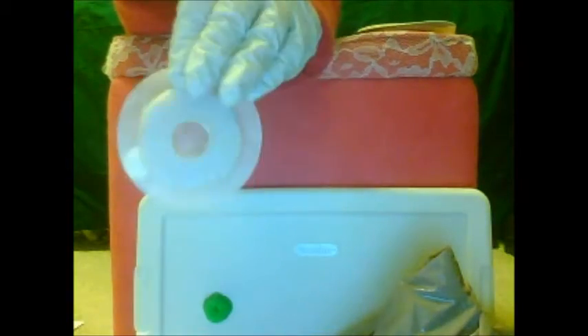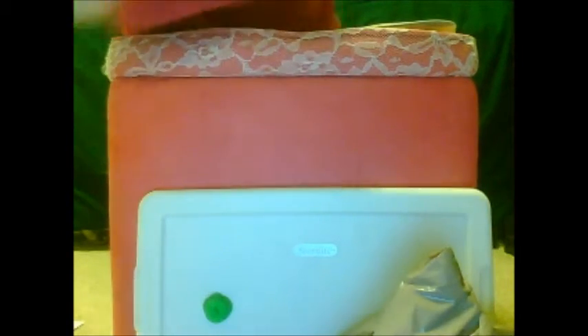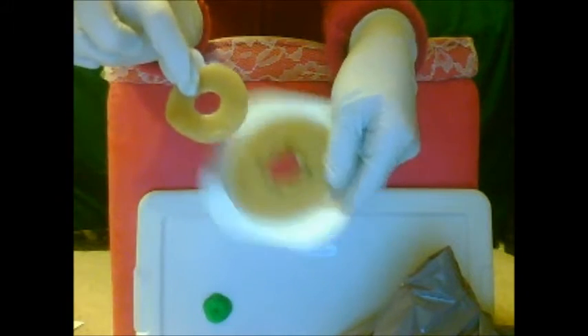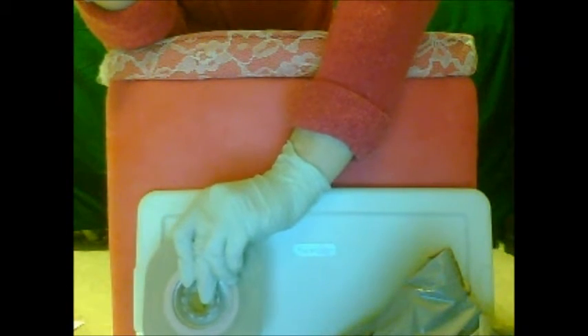This is going to have a skin barrier ring that you usually warm up just to make it more sticky. It's already pretty sticky, but warming it helps it stick better to your skin and to the flange or wafer. It's going to go right on there, pretty much in line with what you cut out, but sticking in a little bit — the hole will be a little bit smaller than what you cut.